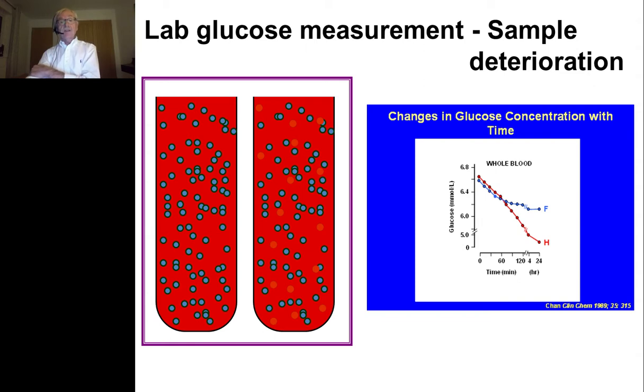After about 1.5 hours, the glucose loss is stopped, whereas if there's no glucose blocker, then it actually carries on. We can see here, glucose results in our samples are dependent on what the collection material is and length of time after collection. So using glucose to assess glycemia was a problem. We needed something new.